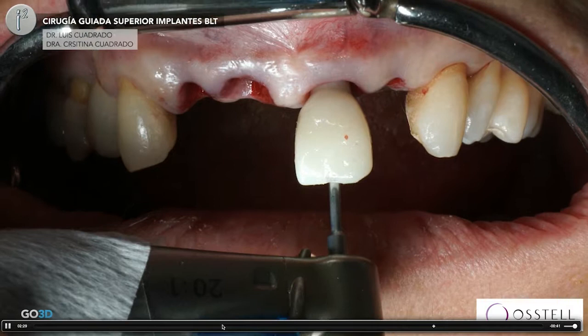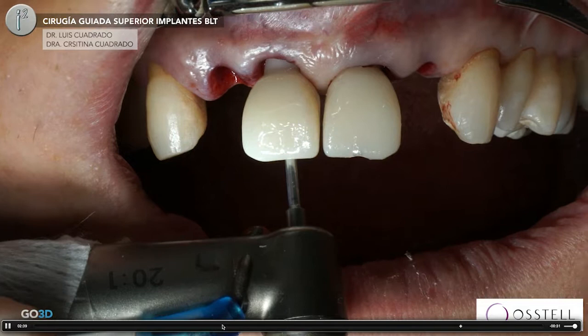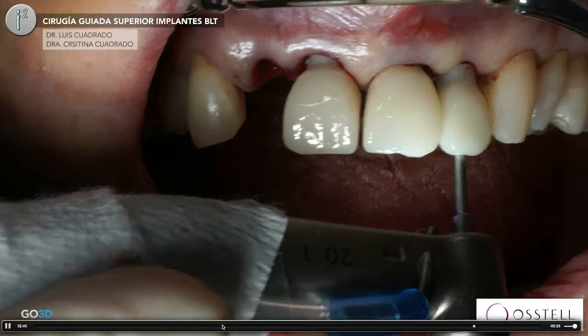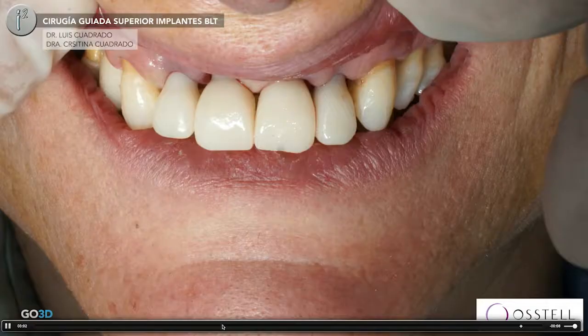Those are the guided crowns, now to place in our patient. Second, third and fourth. We try to avoid any damage to the soft tissue, try to preserve everything to be minimally invasive in the treatments. I think that's the most important thing to get the nicest results because all the soft tissue is going to be remodeled and built around that.